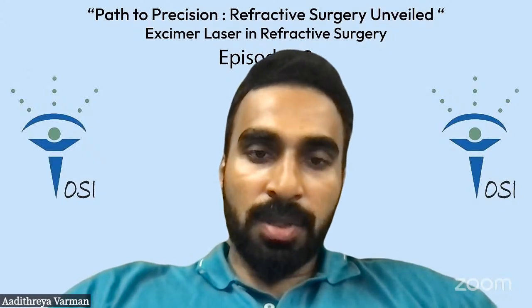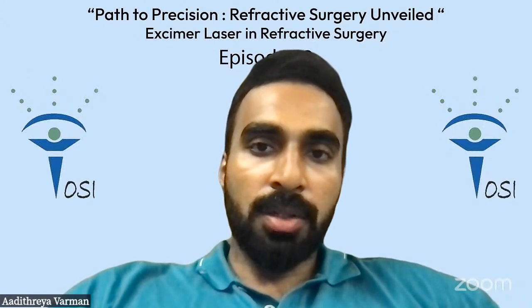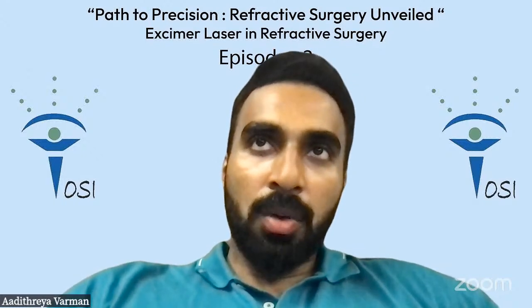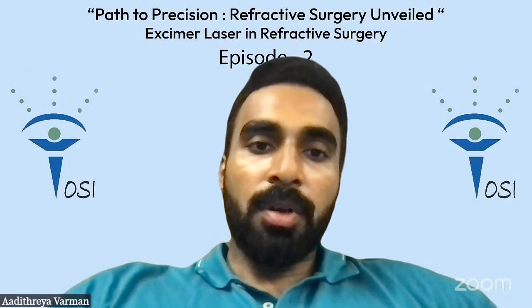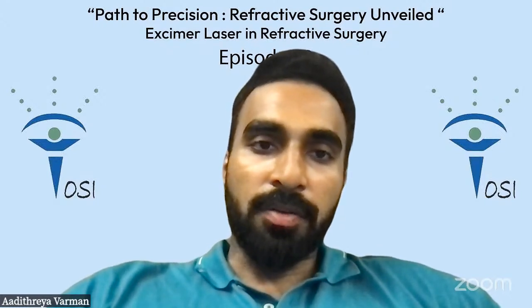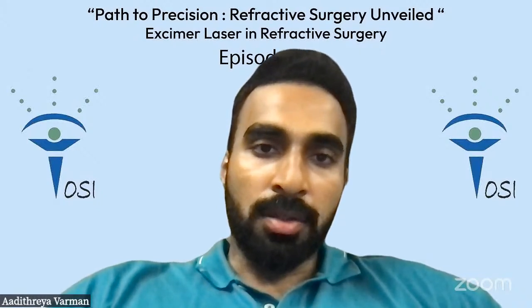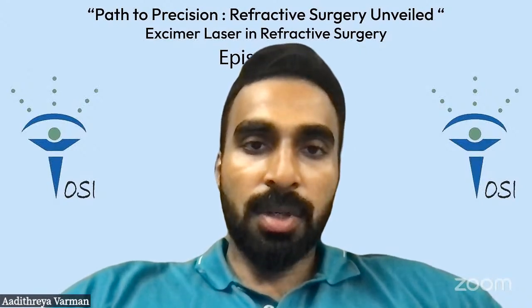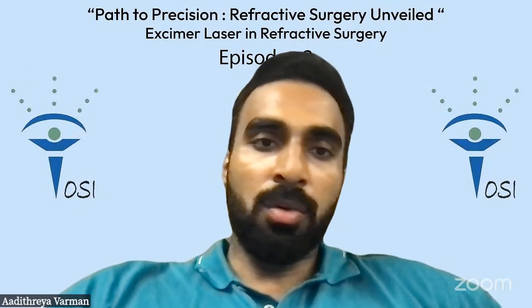For Presbyon in specific, the theory goes, and I've not done this yet, that once you do Presbyon, the patient develops cataract 10 years later or whatever. You target plano in the dominant eye and the same refraction of minus 1.5 in the non-dominant eye, because the spherical aberration that you've induced on the cornea is still there. The target is 0.3 to 0.5, right? At that point of time, you have to check on your aberrometer what the spherical aberration on the cornea is. If it is still between 0.3 to 0.5, you choose a lens which has neutral sphericity, that is zero spherical aberration, like the Bausch and Lomb Envista or something. So you put that in.